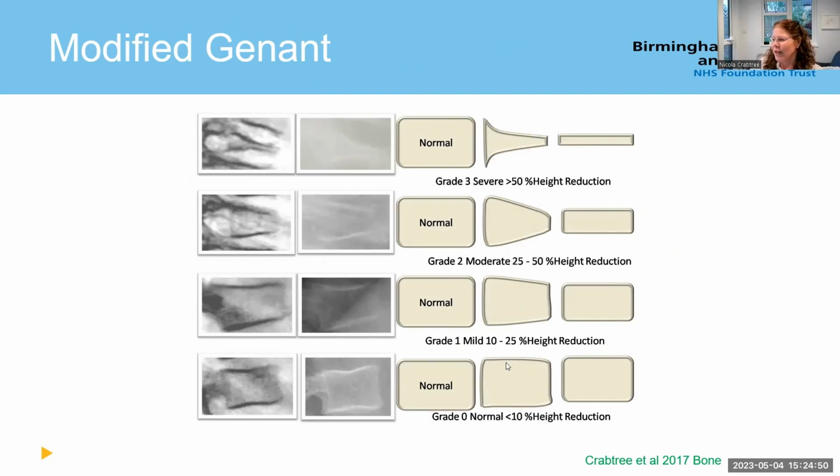And these levels were chosen by our expert paediatric radiologists on the basis that it's very difficult to see a difference between 20 and 25%. And there's some work from CT scans that have been reconstructed in the sagittal plane that have said anything with a deformity of greater than 10% is unlikely to be normal. So that's the rationale behind the thresholds that we use.